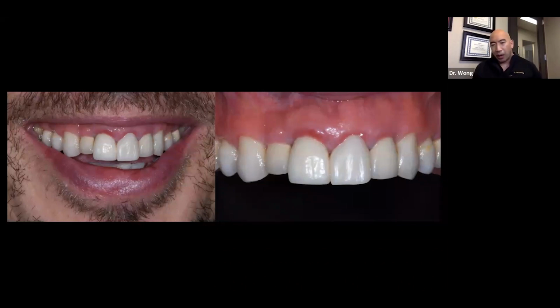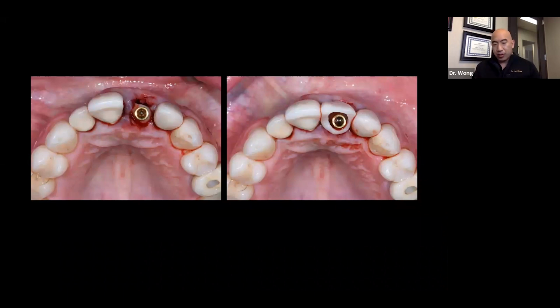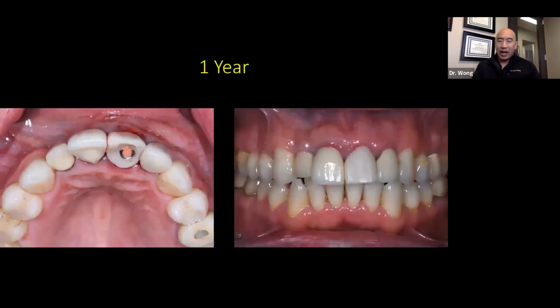So in my practice, being a periodontist, one of the most useful things that I do is implants. Single teeth is what I do most. So as an example, in a situation like this, we're going to replace tooth number 9. I think a lot of people, when they learn implants, get really excited about the possibility of placing an immediate implant. In a situation like this, if you're going to take out a central incisor or any front tooth and put an immediate implant in, it's going to be imperative that you have that CBCT, so that you can prefabricate these temporaries and deliver them to your patient accurately without spending all day in the chair. And if a lab that you work with has access to your digital files, they can plan your implant. We're going to go over all this throughout this whole 2-part series to make sure that implant is dead straight and the temporary is fabricated seamlessly and effortlessly for you.